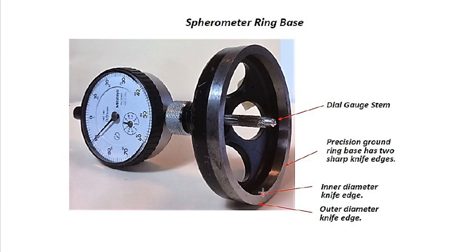This is your inner knife edge, and this one is your outer knife edge. Since they're circles, you have two diameters, from the center to the inner knife edge, and from the center to the outer knife edge. So don't forget that you have two diameters right in there.